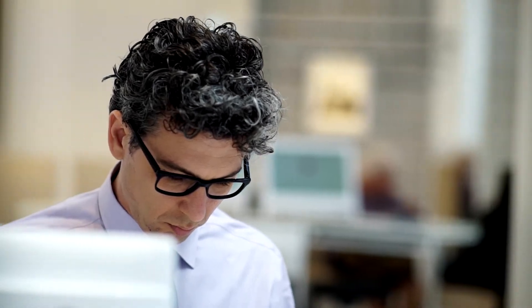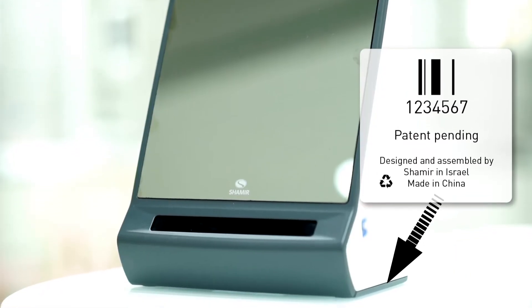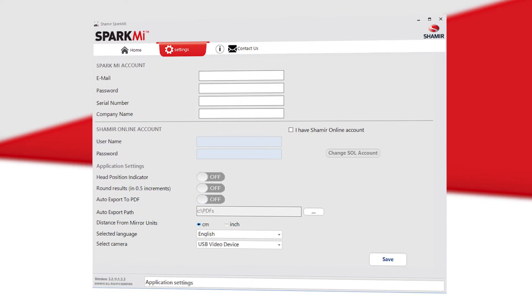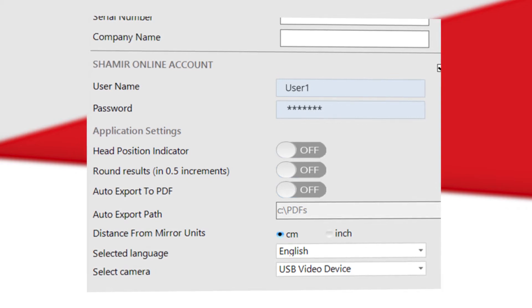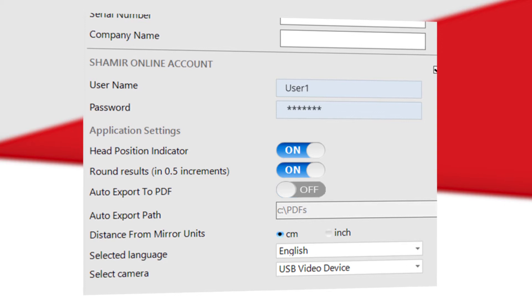After installation has finished, a shortcut will appear on your desktop. Upon launching the application, you will be able to define your app settings: provide your email, password, and your product serial number, which is located at the bottom of your Spark Me device. If you have a Shamir Online account, select the checkbox and type in your Shamir Online account credentials.